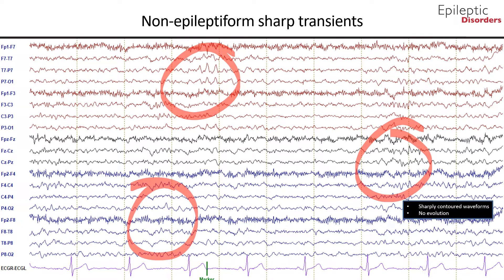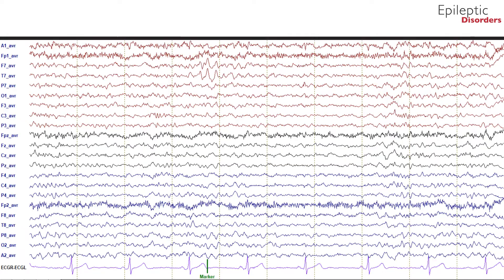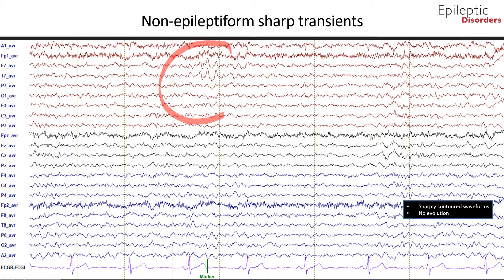There is no evolution to these sharp waves. This is an average montage showing non-epileptiform sharp transients outlined in the red circle. As you can see, sharply contoured waveforms are most pronounced in the left frontal F7 and left temporal T7 region. This is considered to be a normal variant.